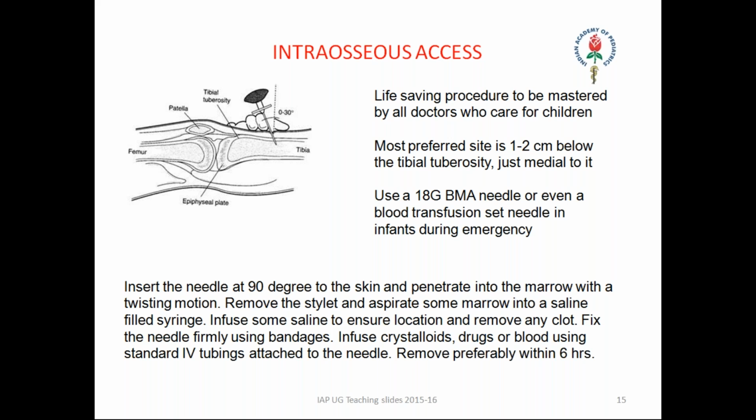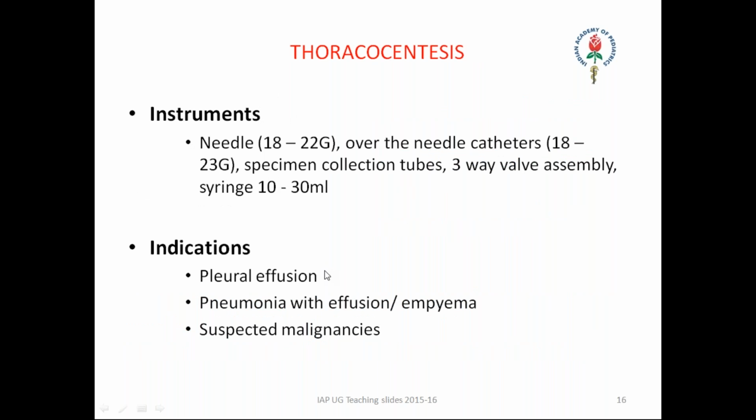After that, you can infuse crystalloids like NS or RL, however much you need, drugs like antiepileptics, and blood using standard IV tubings attached to the needle. But remember, when you give an intraosseous access, you should remove the needle preferably within 6 hours. If you don't remove it, they may get infected and osteomyelitis is expected.